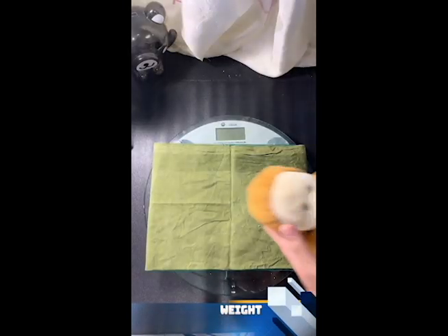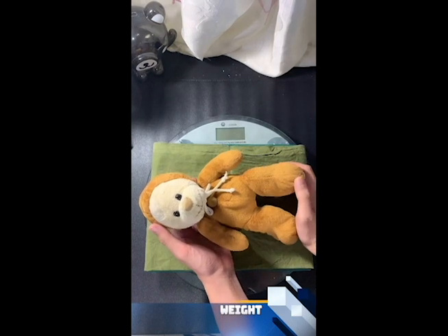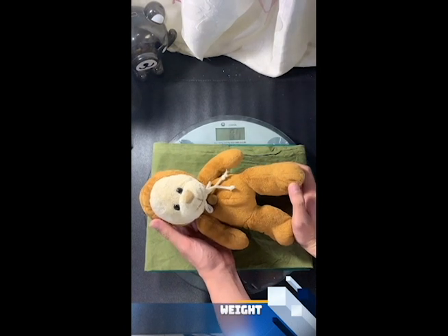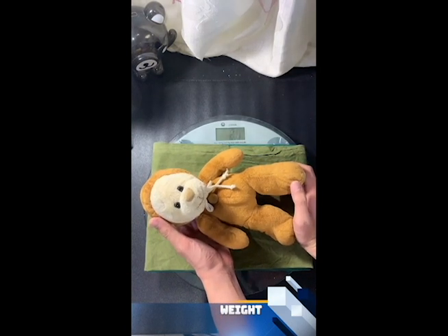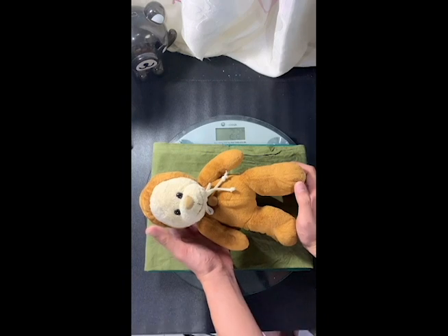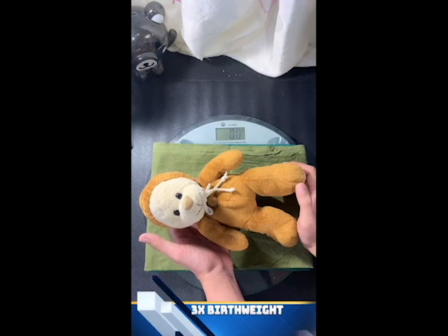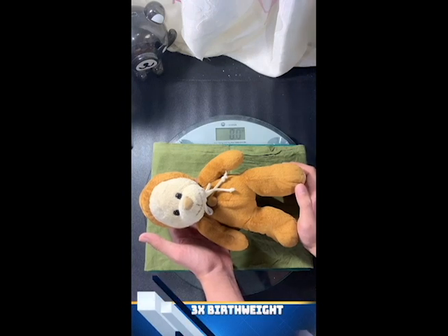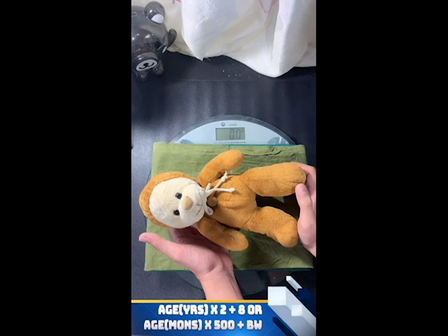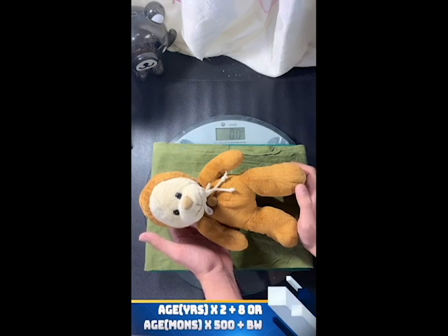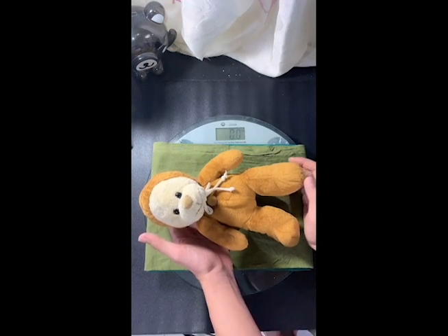The weight of the patient is measured using the infant scale. If not available, we can use the tared scale. The usual weight of an infant at one year old is 3 times the birth weight, and it is calculated using: age in years times 2 plus 8, or weight in grams equals age in months times 500 plus birth weight.